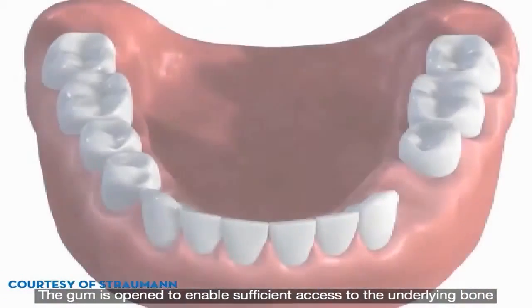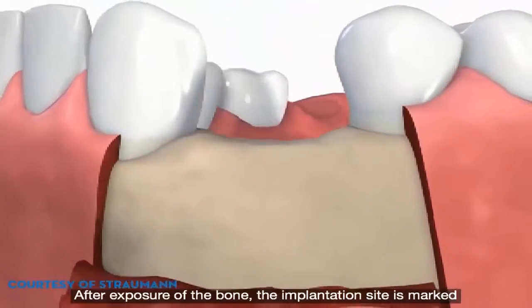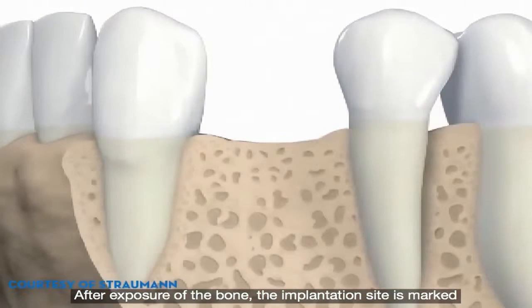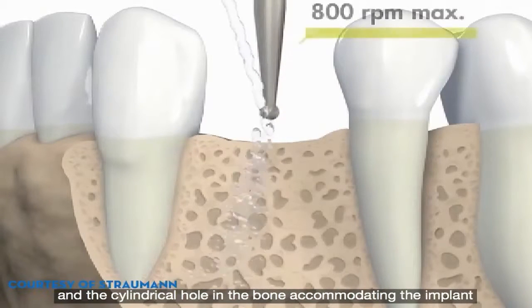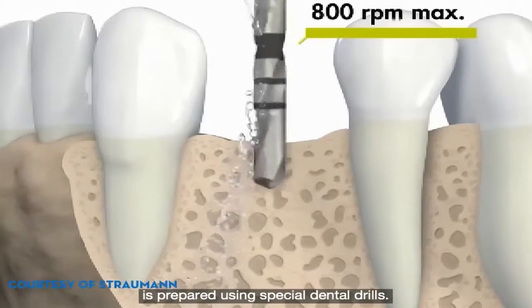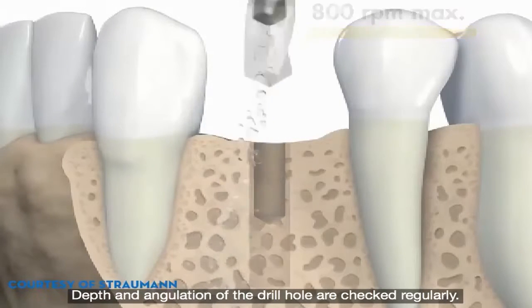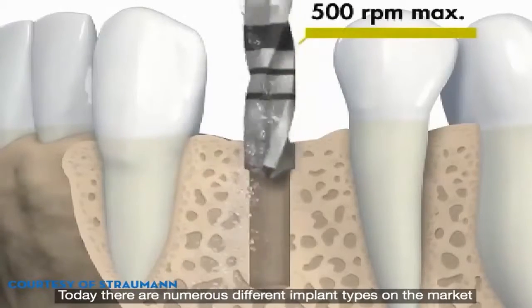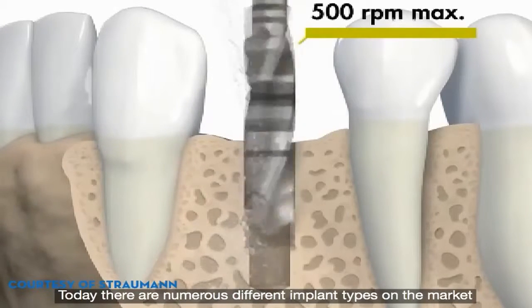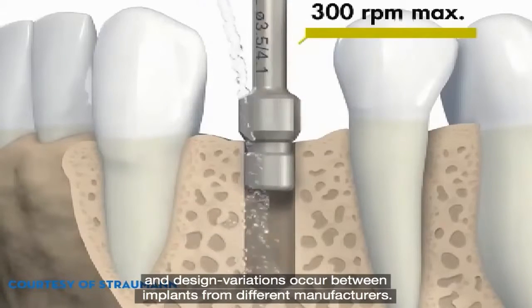The gum is opened to enable sufficient access to the underlying bone. After exposure of the bone, the implantation site is marked and the cylindrical hole in the bone accommodating the implant is prepared using special dental drills. Depth and angulation of the drill hole are checked regularly. There are numerous different implant types on the market and design variations occur between implants from different manufacturers.